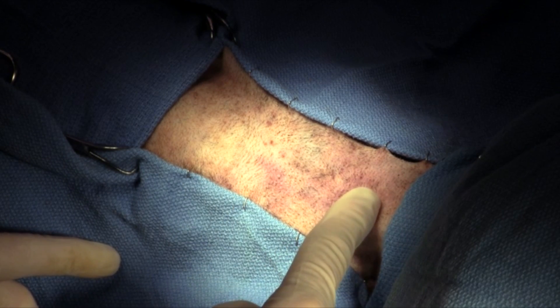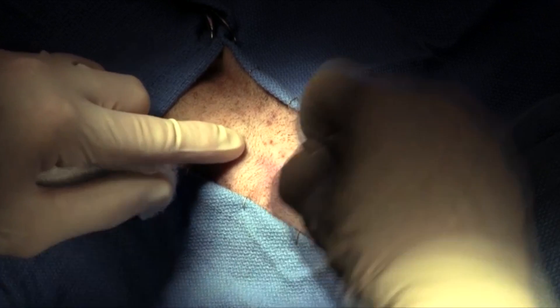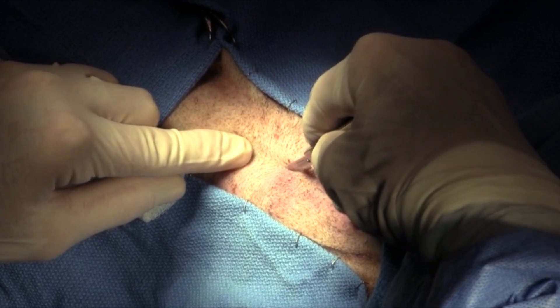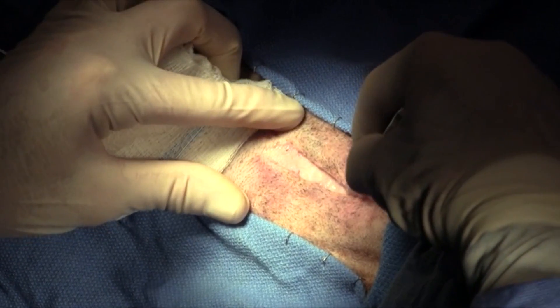The dog is in dorsal recumbency and this is the ventral cervical midline. In a true emergency characterized by life-threatening hypoxemia, aseptic preparation of the ventral neck may not be possible. If not an emergency, or if you can gain control of the airway by standard intubation, this may allow clipping and aseptic preparation of the neck. In either case, a skin incision is made on the ventral midline of the cervical area.